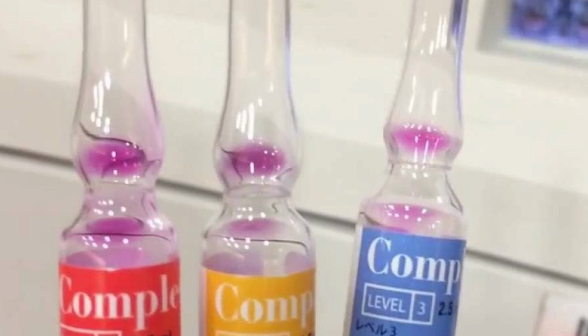Remember also that quality control means that we're going to take some kind of fake substance, most of the time a fake blood, and we're going to introduce it to the machine. The fake blood has been produced by a manufacturer, and the manufacturer has preset what those values should be.